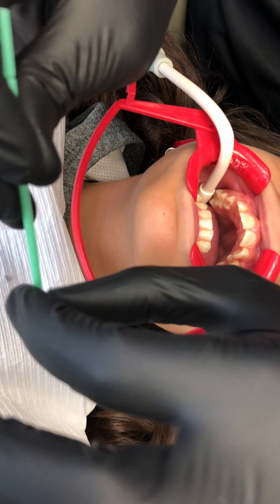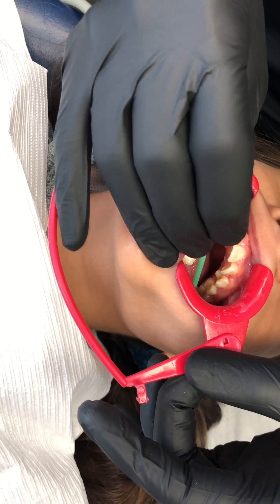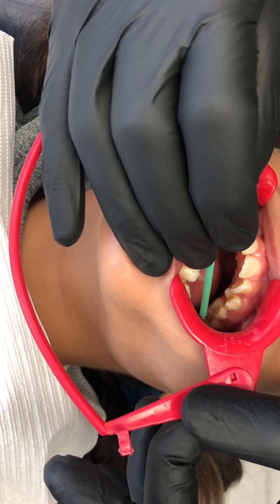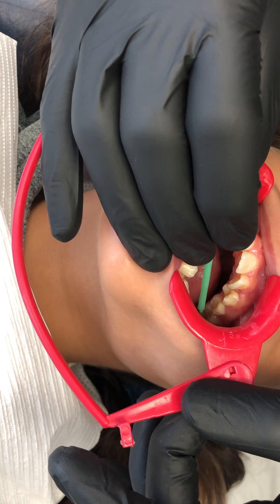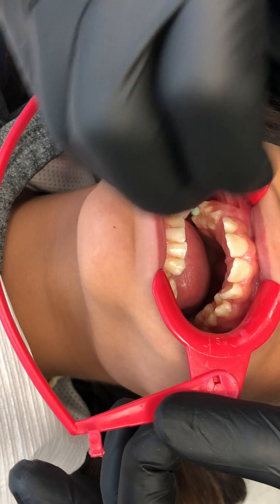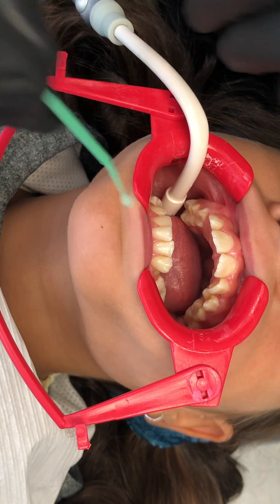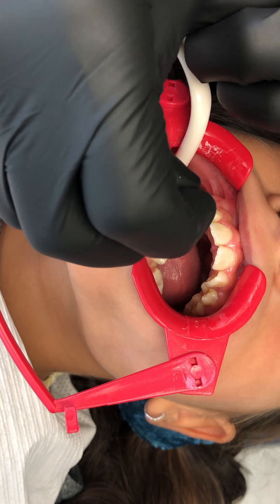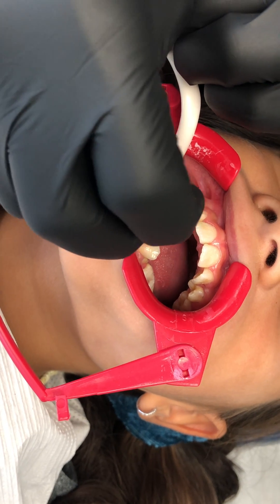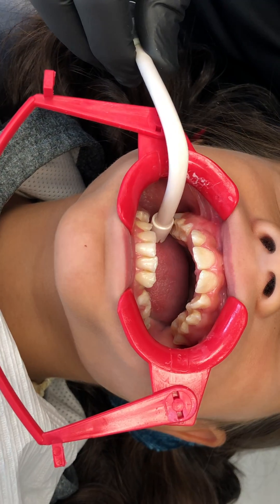We have our standard etch and we're going to etch not only the buccal but also the lingual and palatal surface of the first molar and also over the occlusal a little bit. The band does wrap over the occlusal, so we want to make sure wherever it contacts it's bonding. With these types of expanders there is very little mechanical retention because we're not putting the band up through the gingival margin in between the contact, so we are relying entirely on bonding to retain the appliance. Make sure to etch the entire tooth including the occlusal surfaces. We'll leave that for 30 seconds.